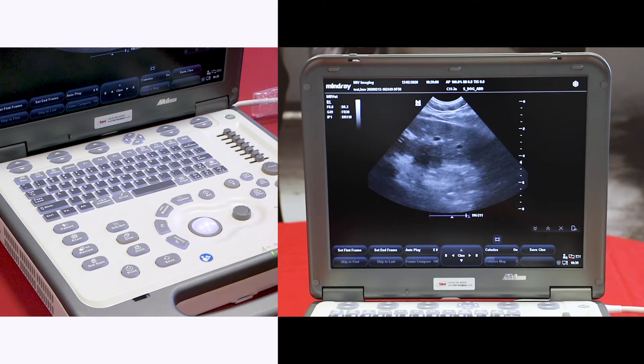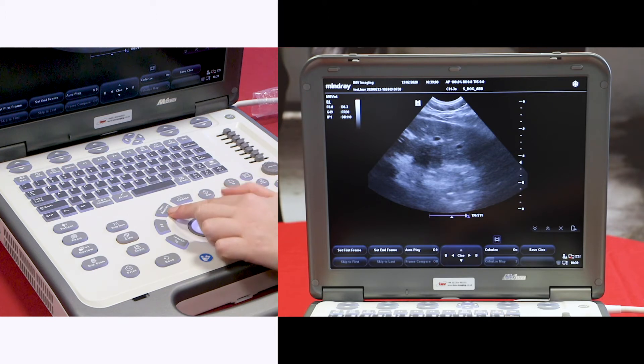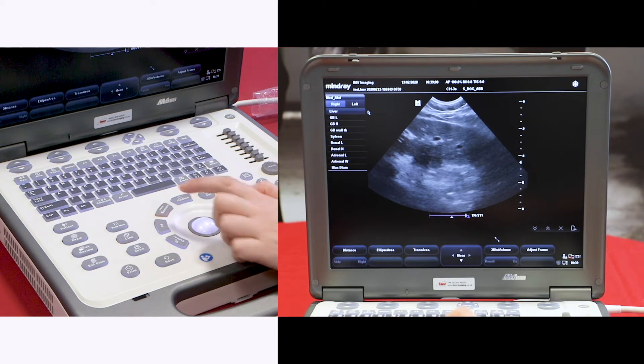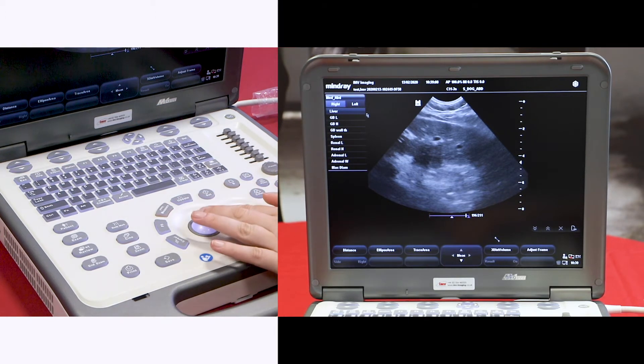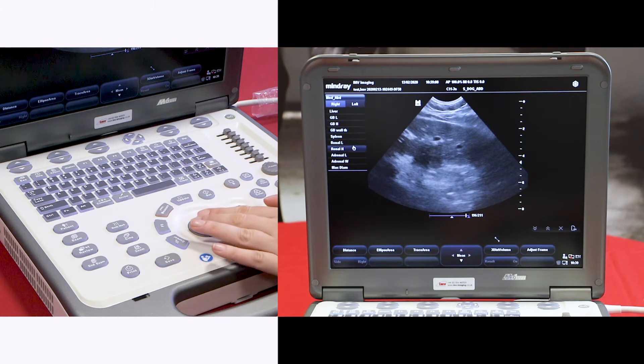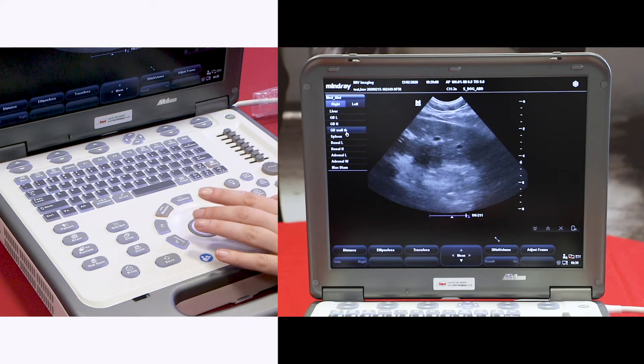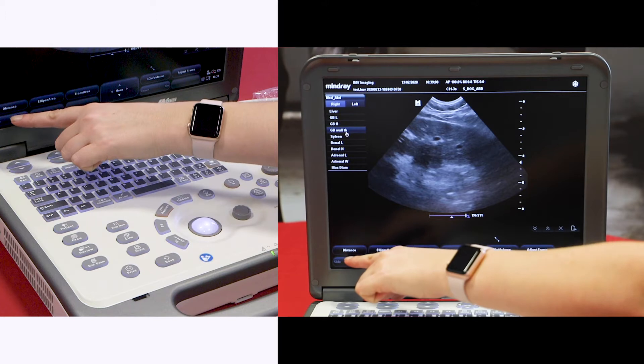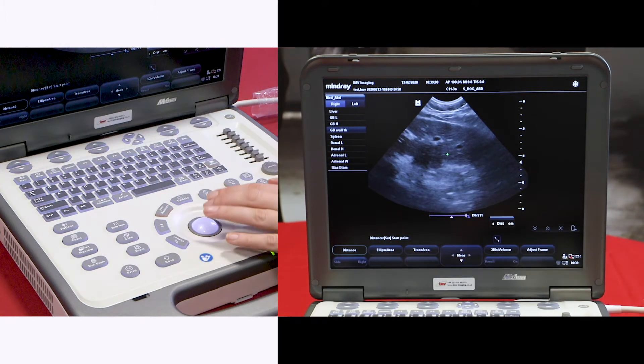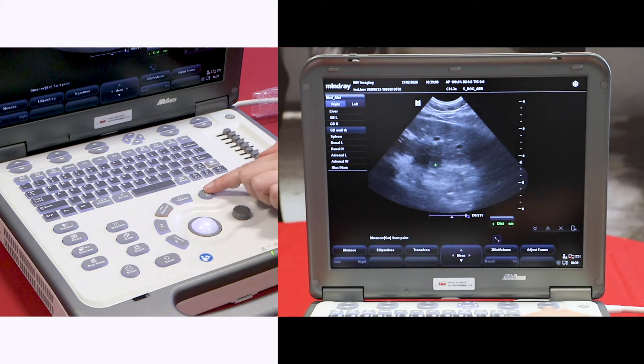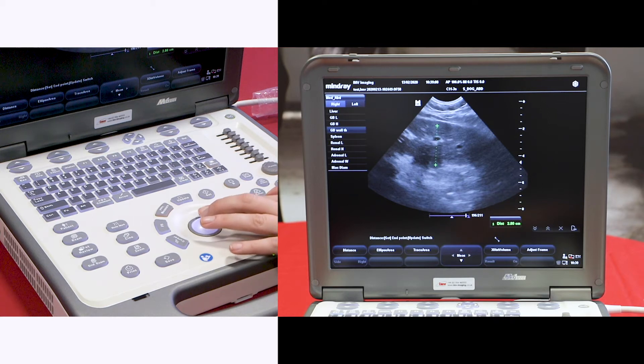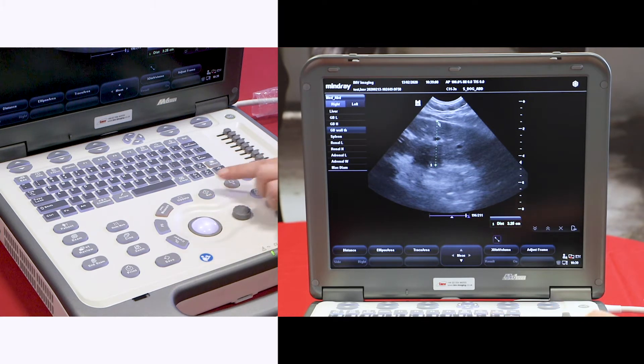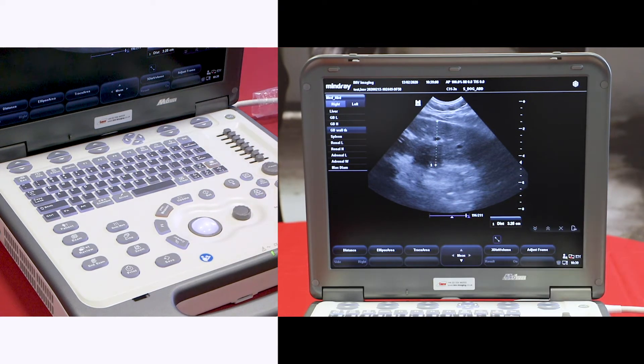To add measurements, the measure button is just above the trackball. If you press here, you can pick from the list what you would like to measure, or you can select distance. Press set to drop the first caliper and set to drop the second. Your distance is displayed on the bottom right hand side of the screen.